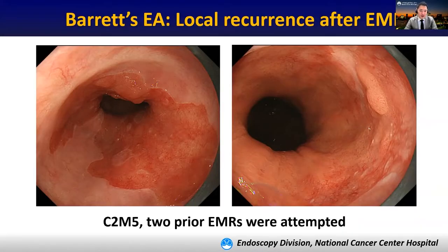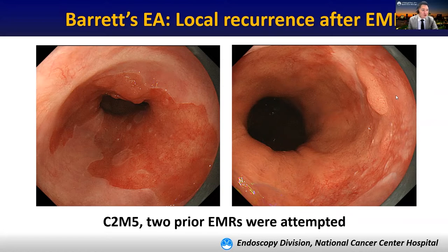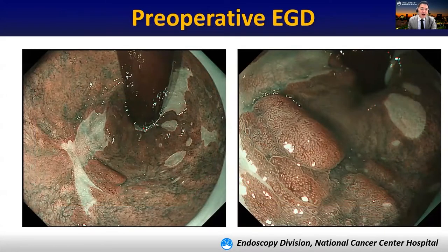Let me show you one case. High-definition white-light endoscopy shows two elevated lesions in Barrett's esophagus, C2M5. A post-EMR scar was covered with squamous epithelium. These two lesions were local recurrence after incomplete endoscopic mucosal resection. NBI magnifying endoscopy showed the tumor demarcation line.